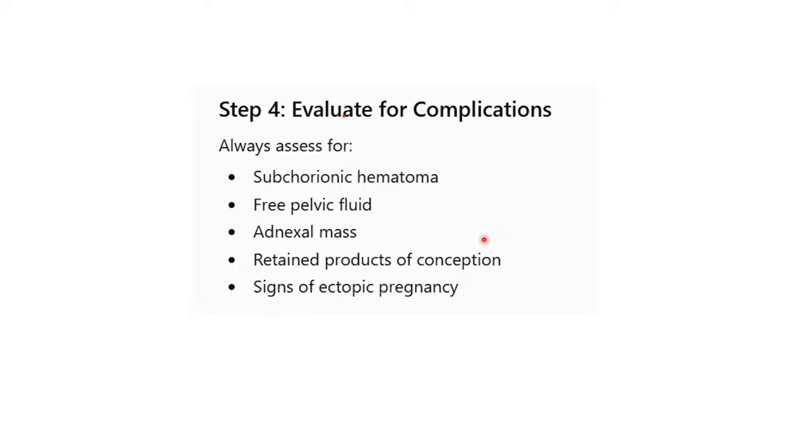Is there free pelvic fluid, be it caused by inflammation, be it caused by rupture of an ectopic pregnancy or anything? So you must take note of that. Are there adnexal masses? You quantify them. How many are they? Localize them. You understand? How big are they? Are they competing for space with the baby?